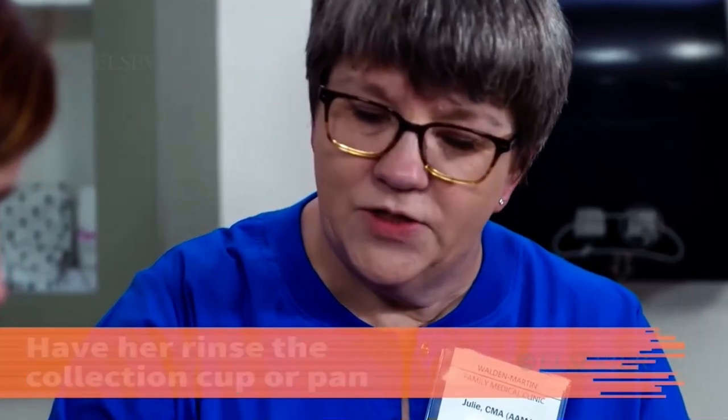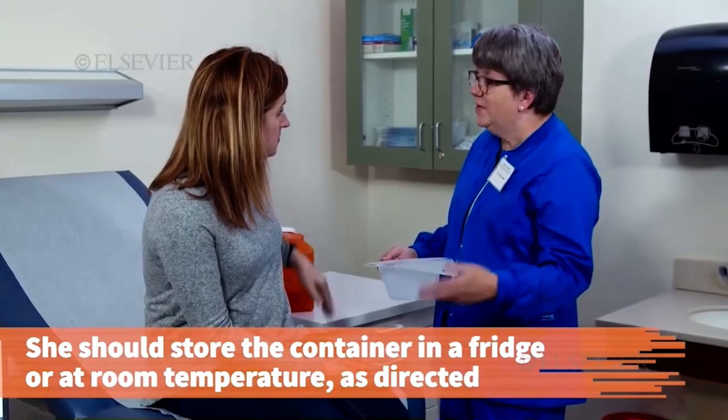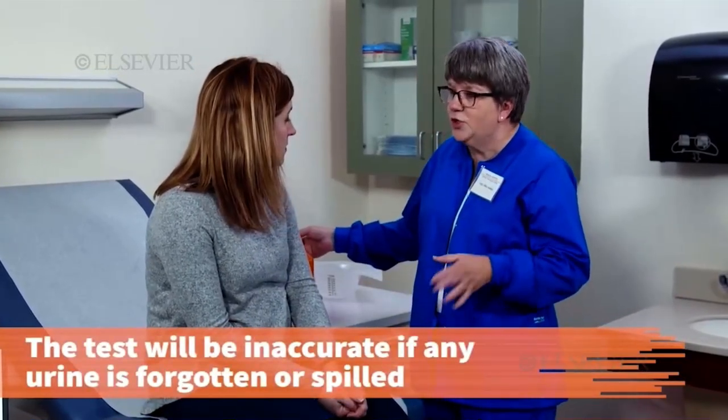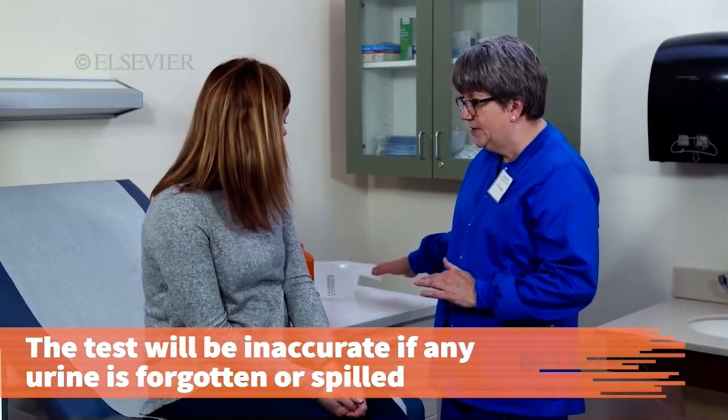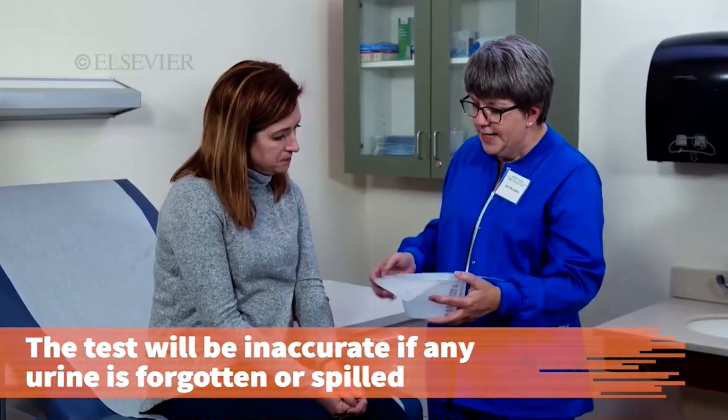She should store the container in the refrigerator or at room temperature, as directed, throughout the 24 hours of the study. The test will be inaccurate if she fails to collect all urine produced over 24 hours. If at any time she forgets to collect her specimen, or if some urine is accidentally spilled, the test must be started all over again with a new container and a newly recorded start time.